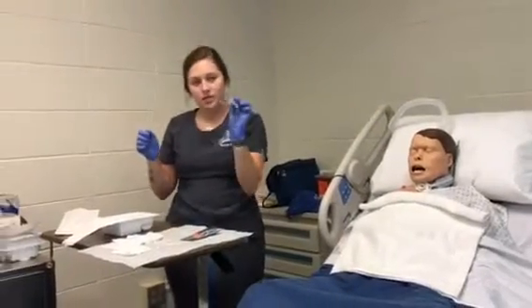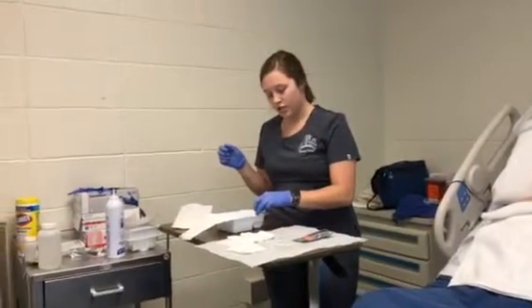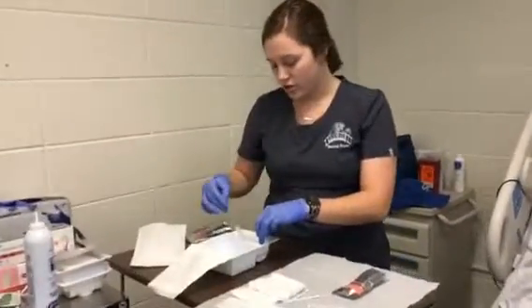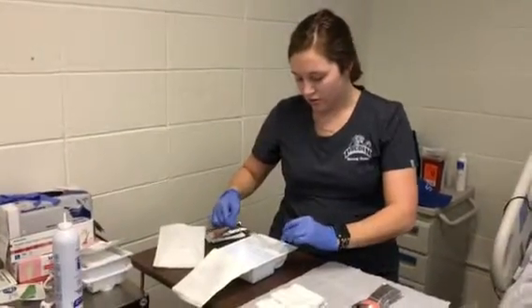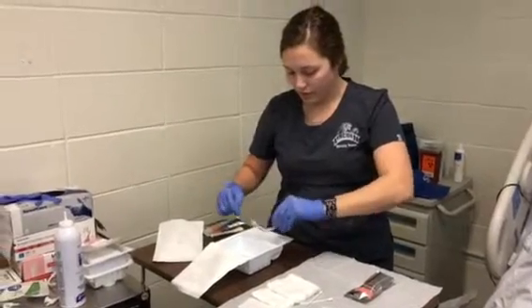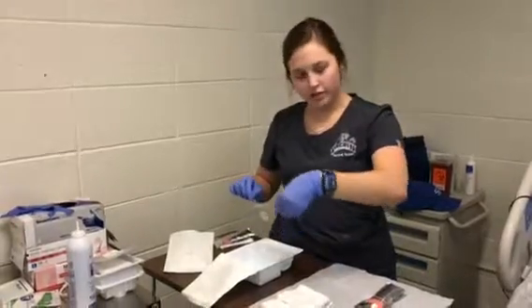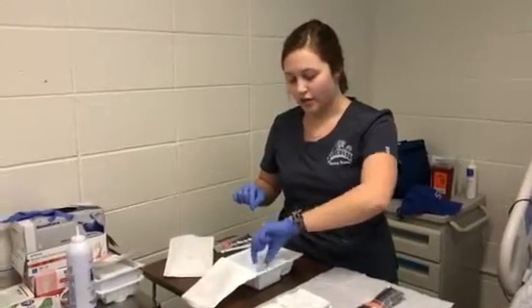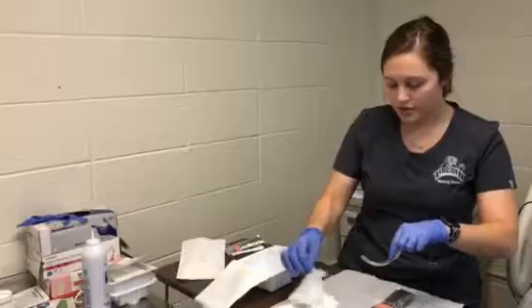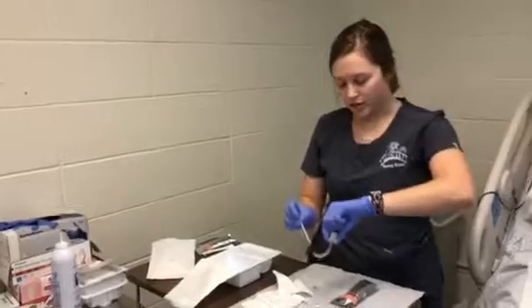Okay, so this, normally you would put this in the hydrogen peroxide and the water mixture to clean. And you're going to take your brush, dip that in, and clean it on the inside and on the outside. Make sure that's nice and clean, and then you're going to put it in the sterile water side and kind of rinse it off. And you're going to take your gauze, dry it off really well. You can use your pipe cleaners to get on the inside.